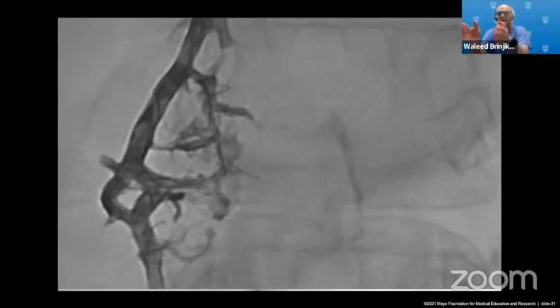Like they say the fistula is at right T11, so I go to right T11 and I treat it there. But the digital subtraction myelogram takes 2 days, you mean? Yes, we're seeing if we can do it in 1 day. But there are limits to how much contrast you can put in the thecal space.